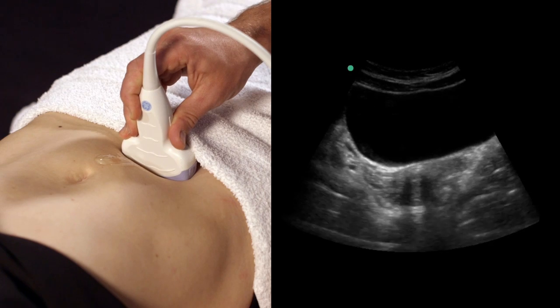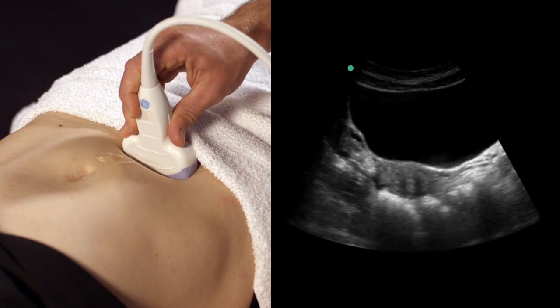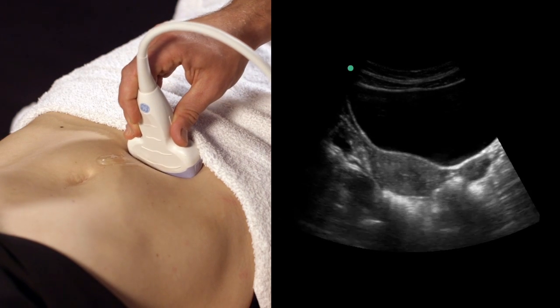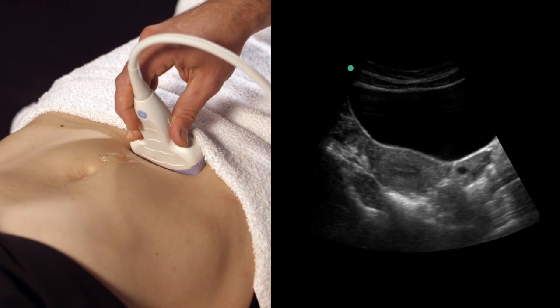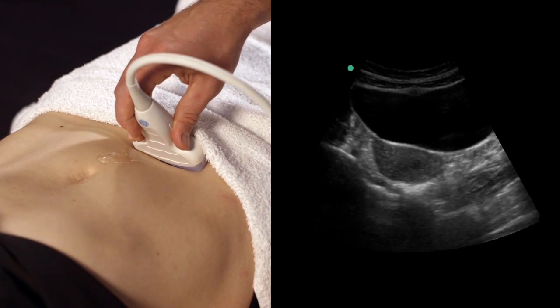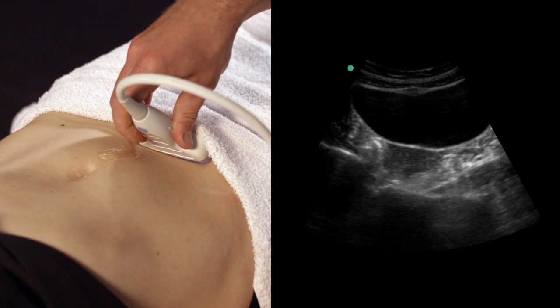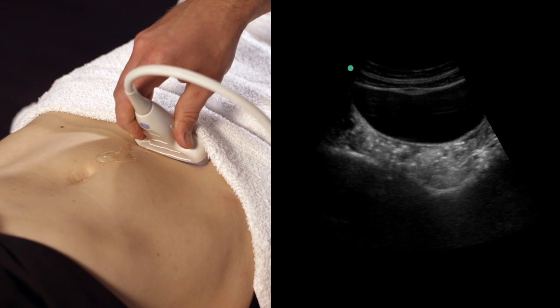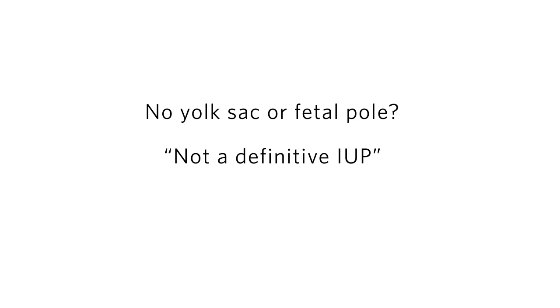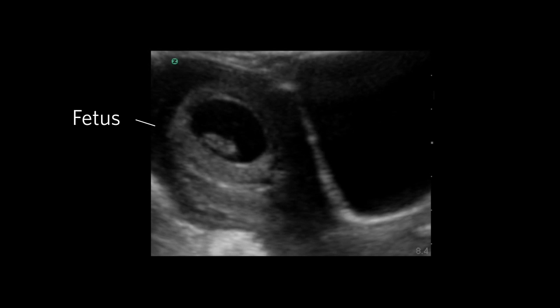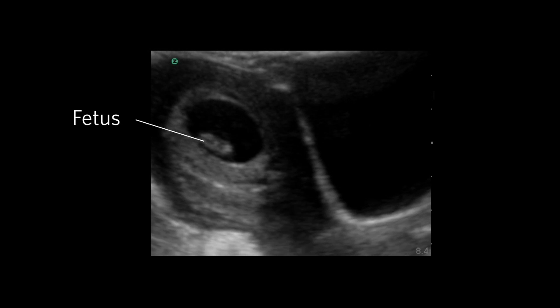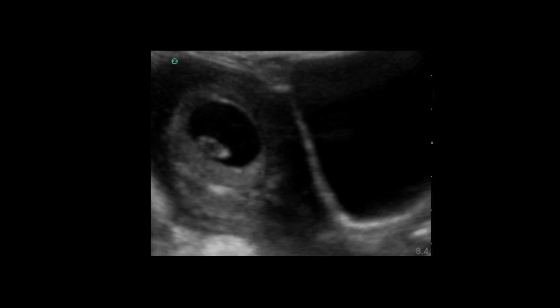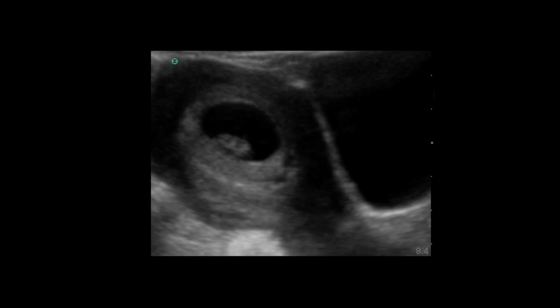You must then ensure the pregnancy is contained within the uterus. If you do not see a yolk sac or a fetal pole within the uterus, you cannot confirm an IUP — you would declare "not a definitive intrauterine pregnancy." If you see a beating heart and you are confident it is in the uterus, you can confirm a live IUP.